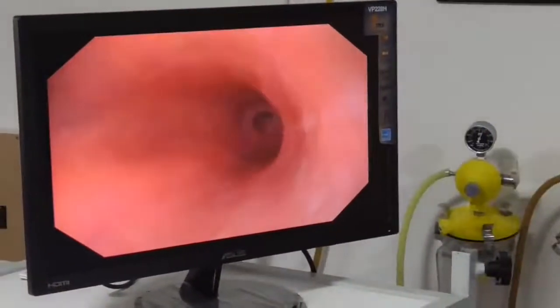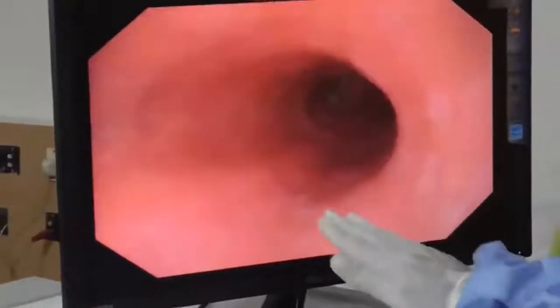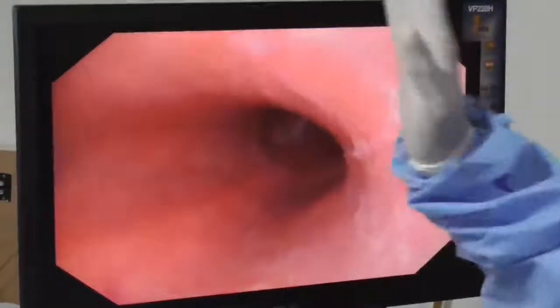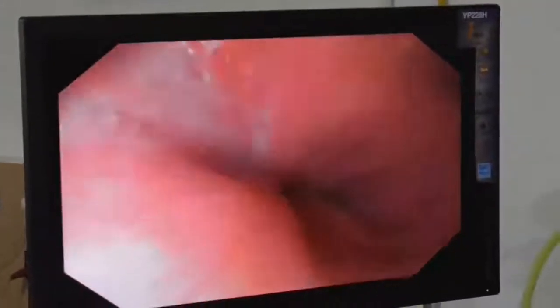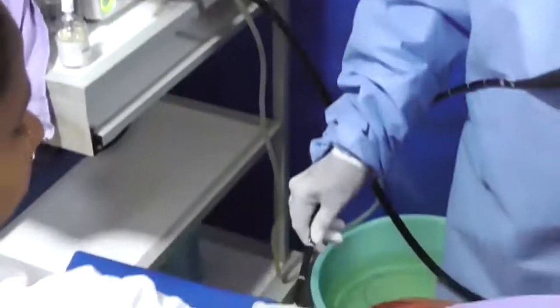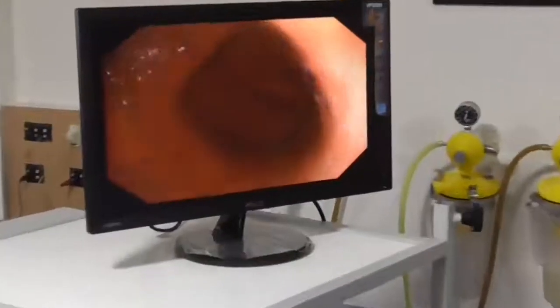The posterior wall lies against the spinal vertebral column. When performing a POEM procedure, sometimes a posterior myotomy or anterior myotomy is performed, so orientation is quite vital for therapeutic interventions. As we go further down at around 40 centimeters you appreciate the transition zone or Z-line, where squamous epithelium changes to columnar epithelium. We are reaching close to 40 centimeters — the hiatus and the Z-line are at the same level. I recognize we have entered the stomach.